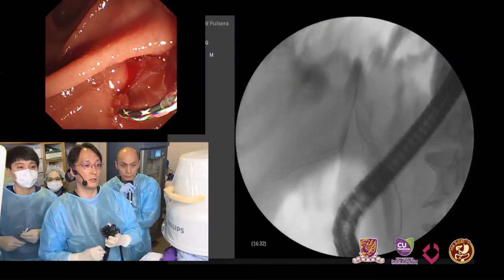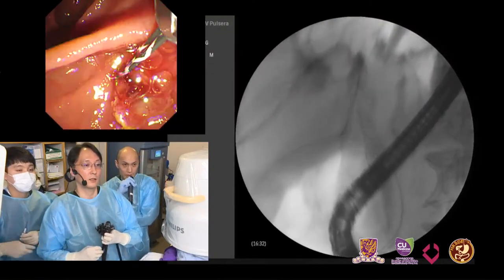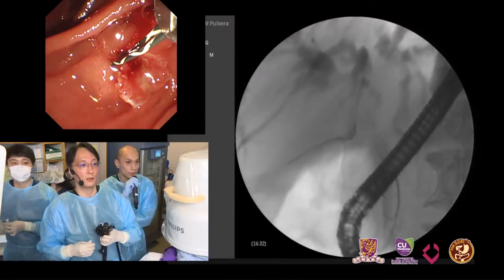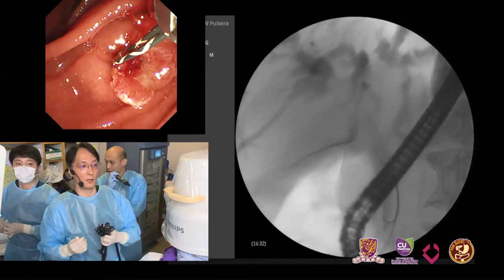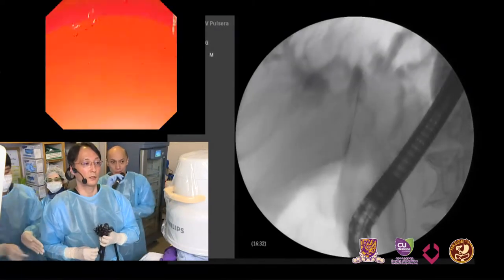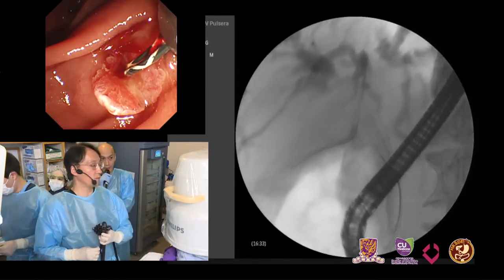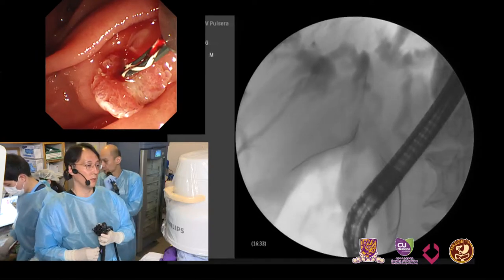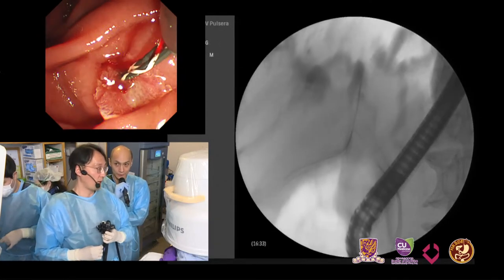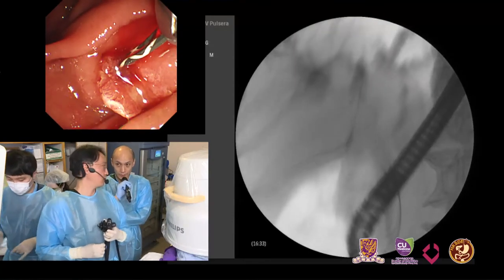Now for the right anterior, the guide wire is a little bit slippery. Well, I think you can still proceed with the posterior stenting first, because it seems like the anterior duct is easy to go in. Yeah, that's true. So you're going to put a Y stent into the right anterior and posterior duct using what system? This one is a Teoh LCD type, which means a very large cell. In my experience there are two kinds of diameters, 8 millimeter and 10 millimeter. I recommend the 10 millimeter because the 8 millimeter has a higher chance of tumor ingrowth.